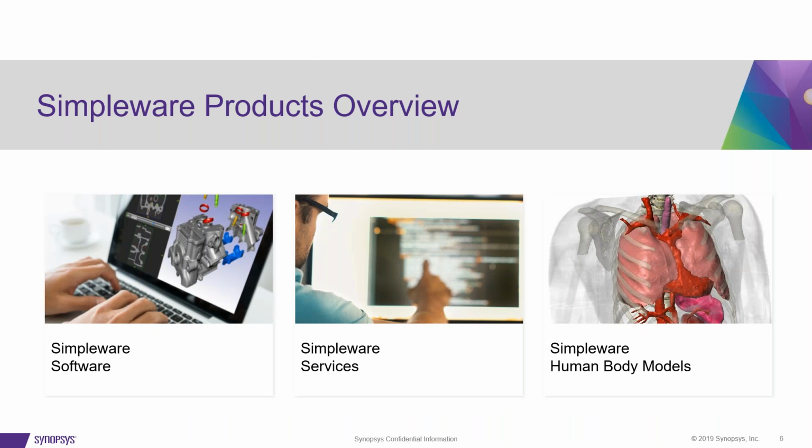So what solutions do we actually offer? These can be split into three main branches. We have our flagship product, the Simpleware software itself, which is an easy to use GUI-based software solution for processing 3D image data and building computer models from that data for visualization, measurement and analysis, and also export for various applications such as 3D printing, CAD design work, and even computational simulations that are actually based on reality.